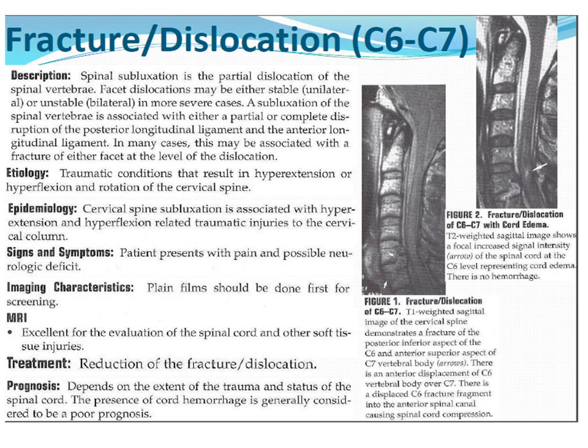But if there's enough of a narrowing of the canal there, they may want to open it up surgically in order to give that cord a chance to heal. Depending on how bad it is, this may heal, or sometimes the cord may always be a little bit thin there. They may get a little bit of myelomalacia when it heals, but eventually that T2 weighted signal will go away.